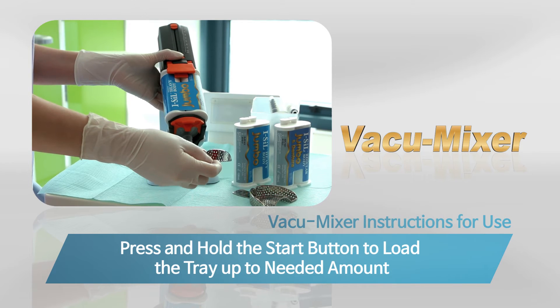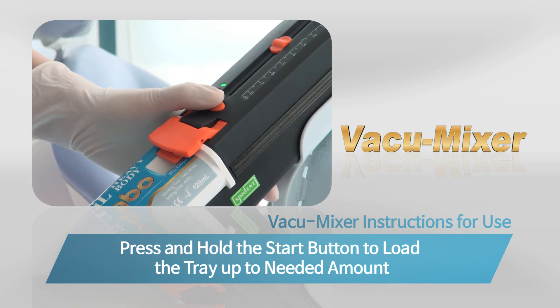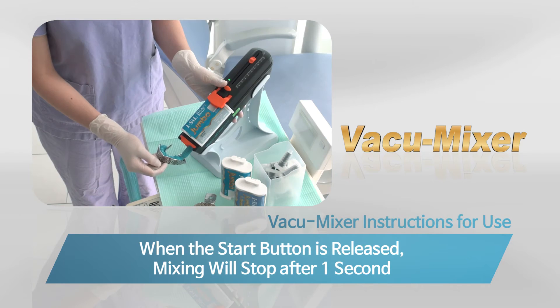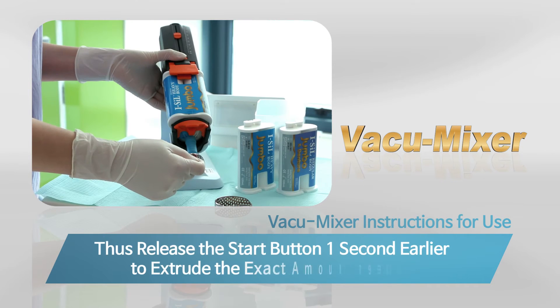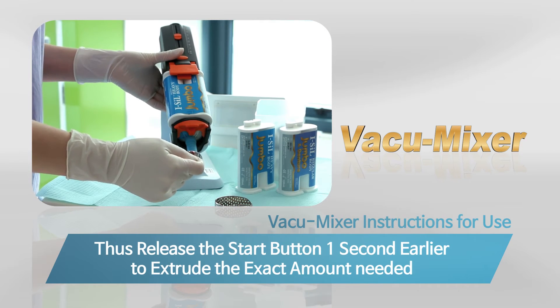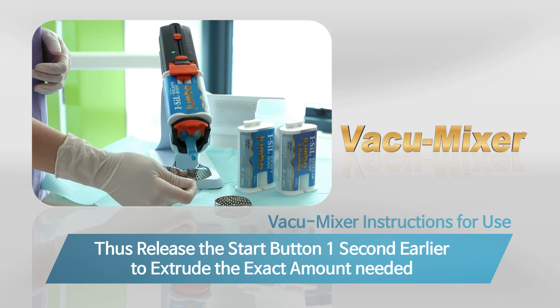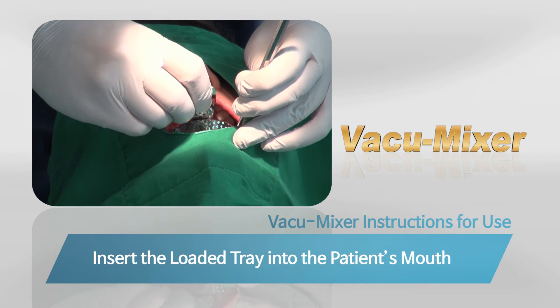Push the plunger forward prior to extrusion. Press and hold the start button to begin automatic mixing until the tray is filled as needed. When the start button is released, mixing will conclude after a delay of approximately one second — it is recommended to release the button one second early to extrude the exact amount needed. Finally, insert the loaded tray into the patient's mouth.